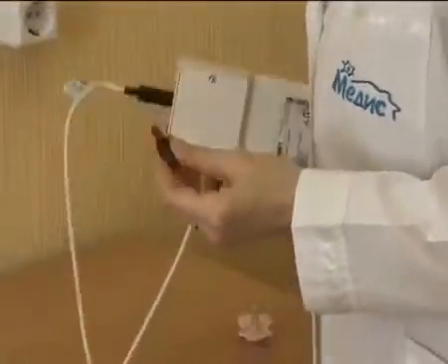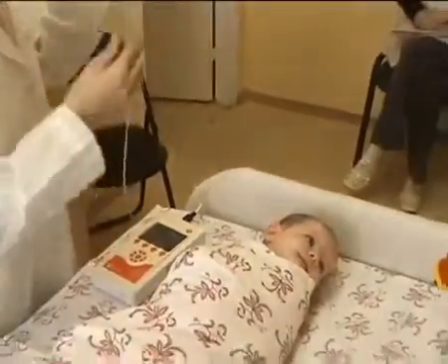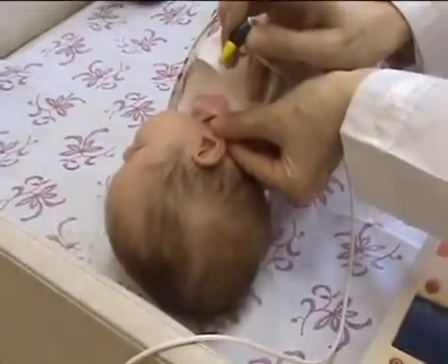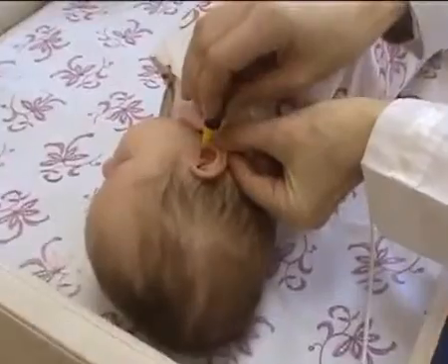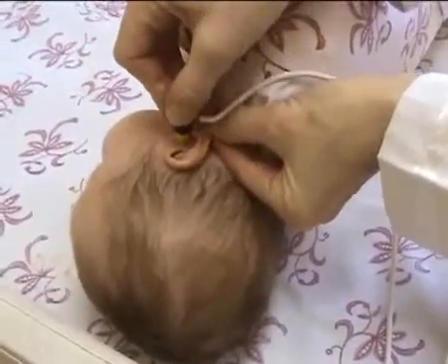The ear canals of newborns are very elastic and can change form at a gentle touch. First of all, make sure that the ear canal is opened and directed straight up. To insert the probe into the ear canal, first pull down and back on the pinna. This will straighten the ear canal and make probe placement more effective.